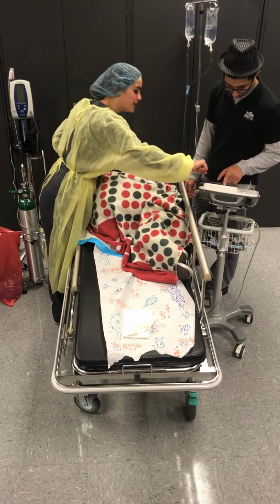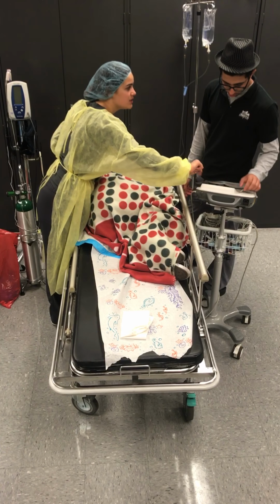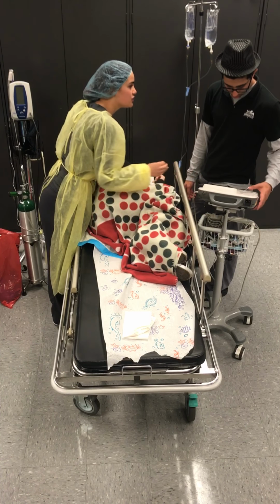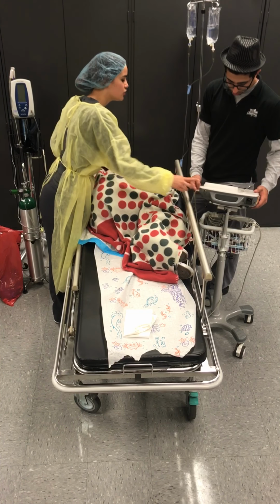Dad, if you see this machine right here, this is the fetal monitor. So if you see those waves right there, when they're at their highest, that means that she's having a contraction and it's hurting her the most. So when it goes down, you're just going to tell her to take a deep breath, okay? Perfect. I need you to be watching that for me.